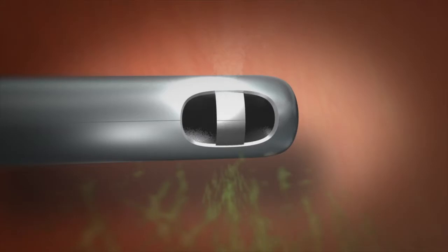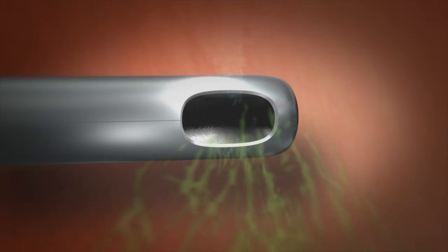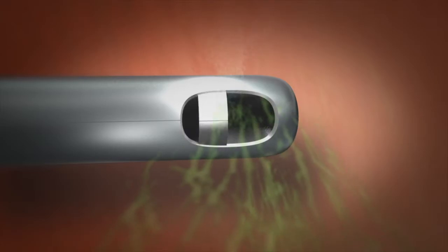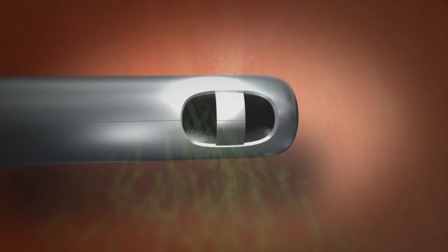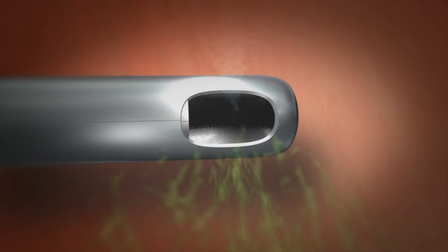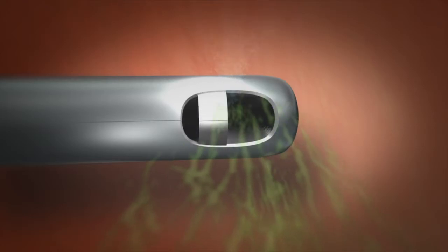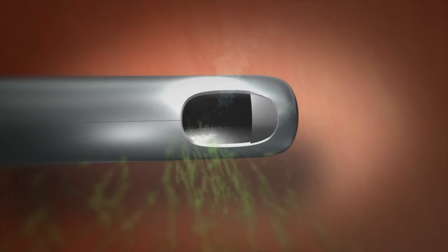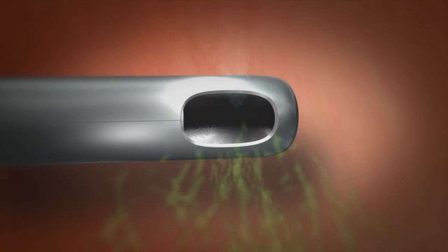Let me explain. When the BSS flow has attracted and deformed the vitreous to bring it into the port, at the moment when the knife is going to cut the fibers, a neighboring fiber will be sucked by the upper port behind the knife, and when these neighboring fibers are cut, the lower port will be open and active again.